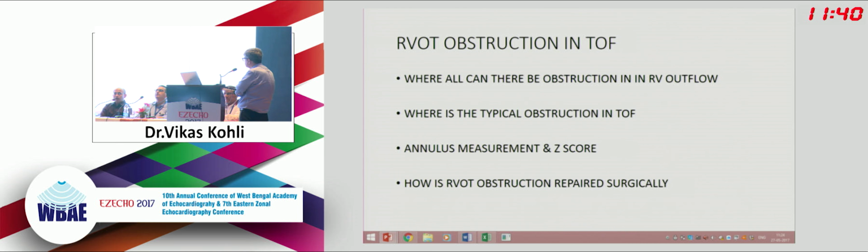This is one of those. And the other thing is, if we do not standardize, then the valve measurements might be different at different ages.